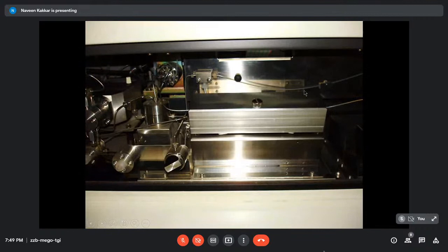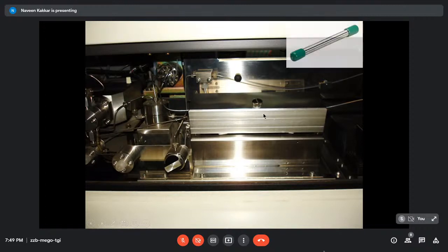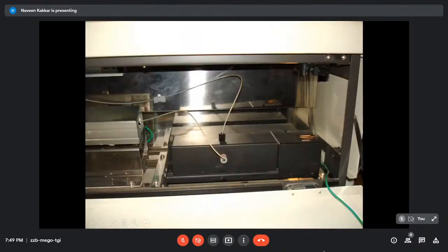Remember the pumps over here? This is where the thermo cartridge is housed. If you unscrew this, you will find a long case where you can place the cartridge. This is how the cartridge, or the column, looks, and you place it across both ends here. When the pump throws in the fluid containing all hemoglobins, it is separated out in the column and then moves out through the other tube. The output from the column then goes to the detector. That black part is the detector, and it looks at the hemoglobins coming in at different times, and by their wavelength decides which one is which.